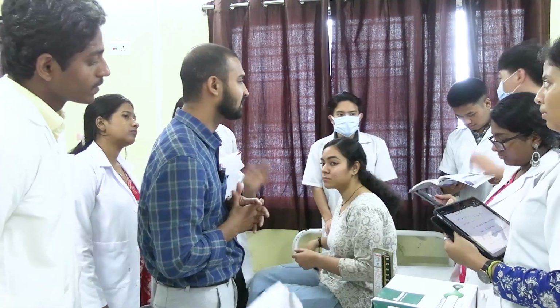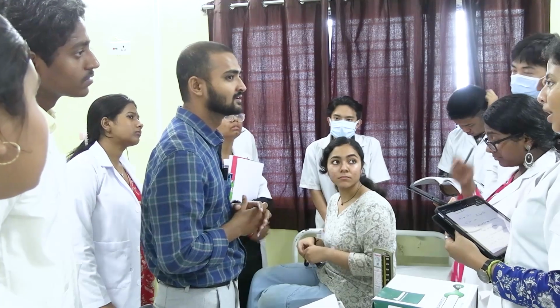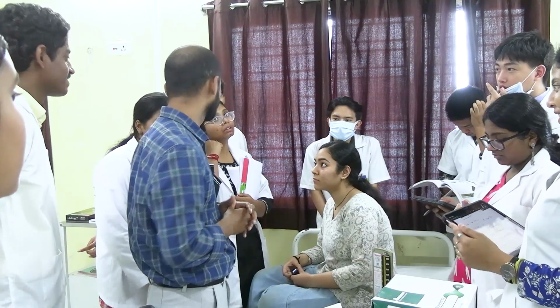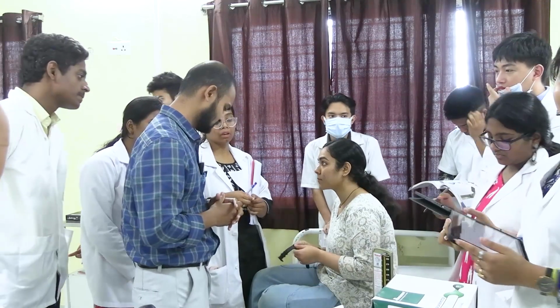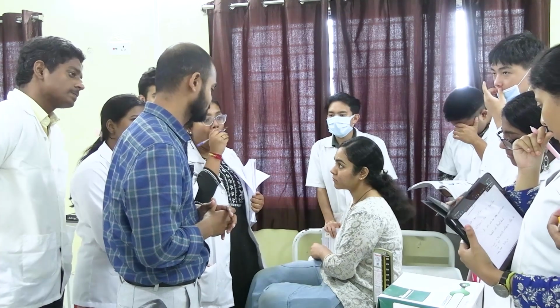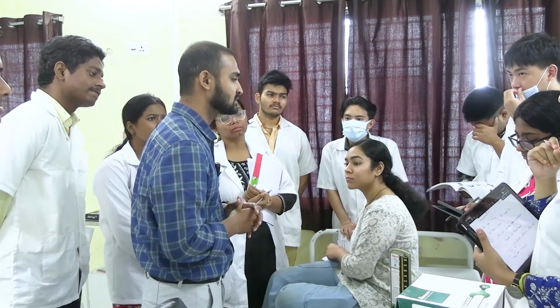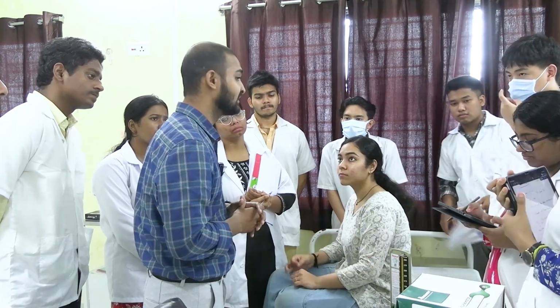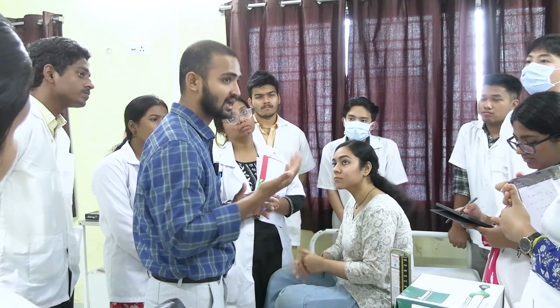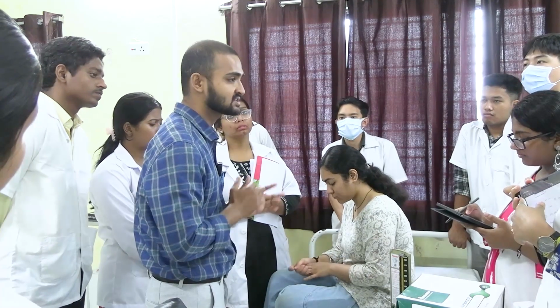Accurate systolic pressure. So when you don't have to connect the stethoscope. Okay. So what is the advantage? So this helps us. Suppose in certain patient you might get a BP which is very much higher. Suppose you have raised till 200 mmHg and the patient is hypertensive.